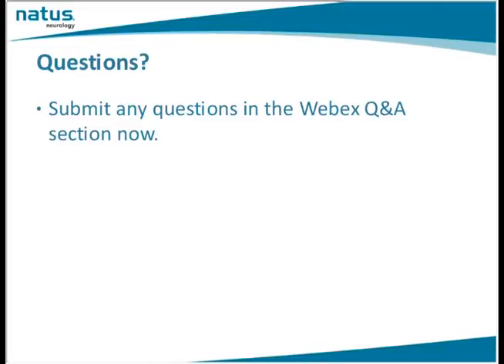Okay, we have one last question. If there's any others, please send them in now. Can the monitoring probes be used for diagnostic applications? You know, it can, Katie. They're the same frequency. Of course, they're 2 meg.